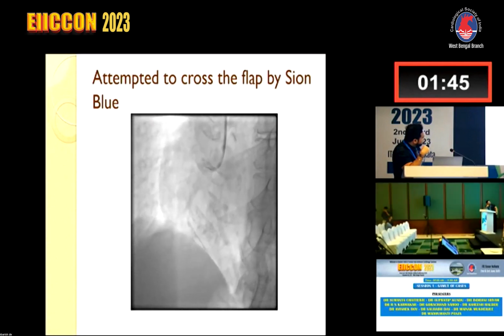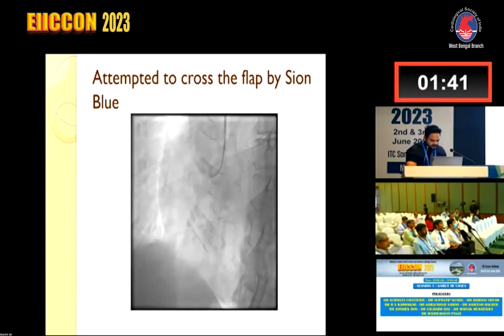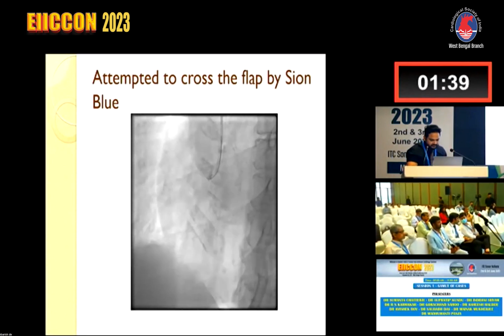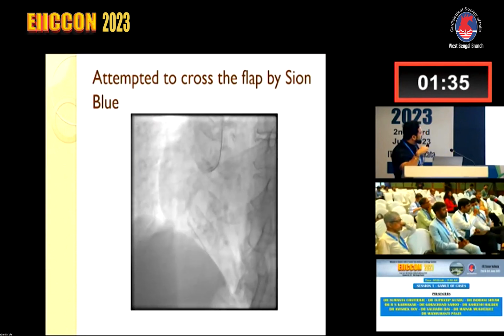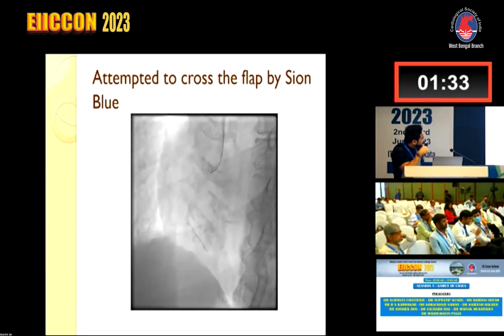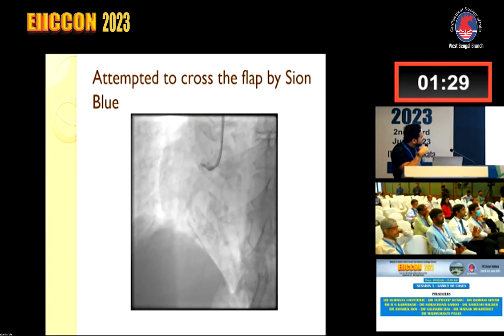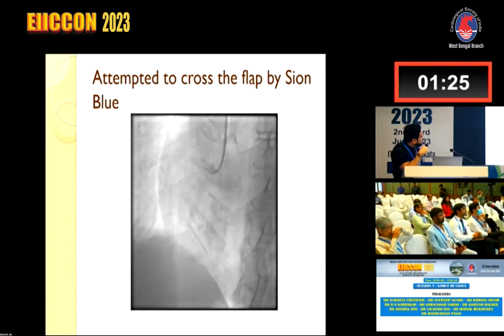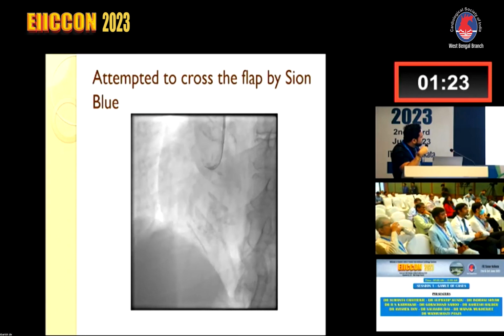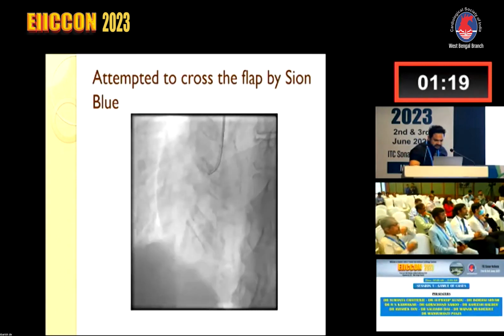Later on, I'll just forward it a bit. So you can see we will be going into the conal branch. Okay, I'll have to forward this.